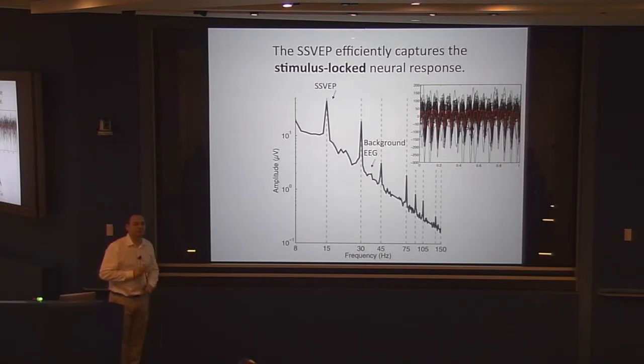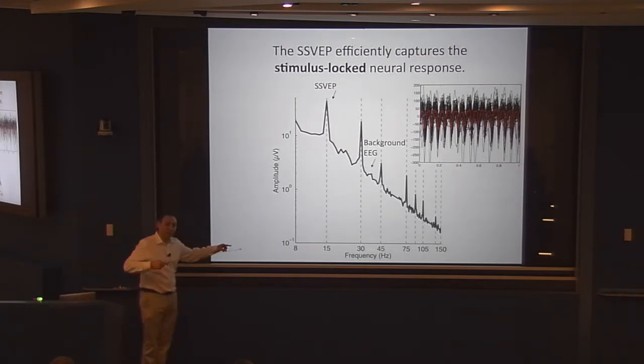Like, do you know, does the resistance vary between electrodes? Do you know if that filtering is to do with capacitive coupling? Yes, the answer is it does, and I actually meant to say something about that when I showed you the brain image, but I didn't dwell on it. Sometimes the electrodes are partially sitting over vessels, and sometimes they make a good contact with the cortex. Sometimes they sit over a sulcus, they span a sulcus, and those things matter.